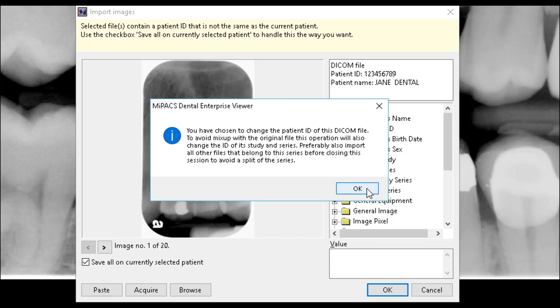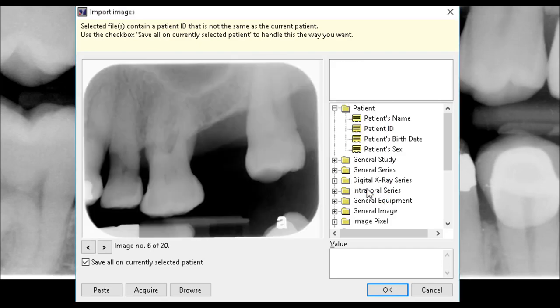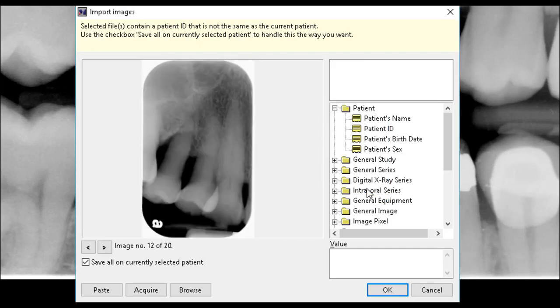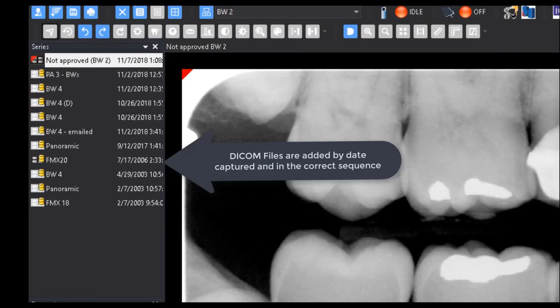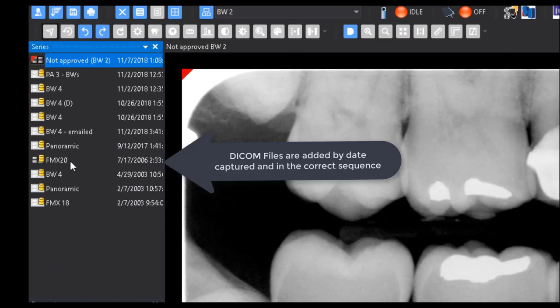You will receive a message informing you of the changes about to be made to the files. Select OK to finalize the import. The DICOM files have now been imported into MyPax and will appear in the Series view by date captured in the correct sequence.